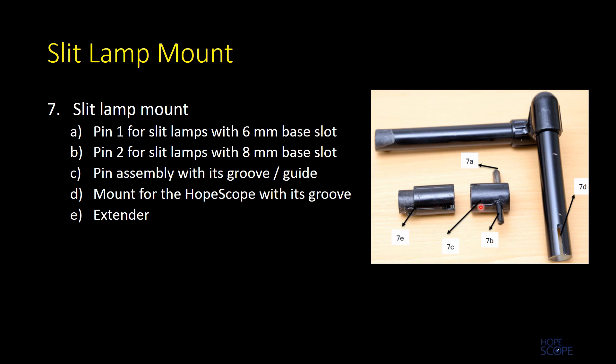The pin is fixed to the pin assembly and the pin assembly has grooves which guide correct alignment when fixing to the mount. The other end of the mount has grooves which guide proper alignment when connecting to the HopeScope. There is an optional extender for use with devices requiring the optical tube expander, since using the expander increases the overall length of the optical tube, and the extender compensates by elongating the slit lamp mount.